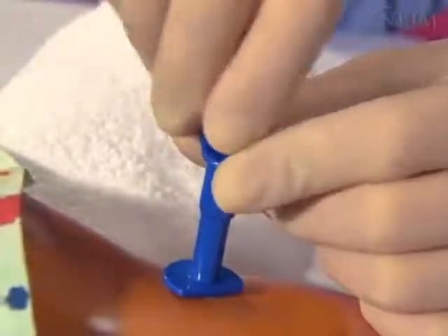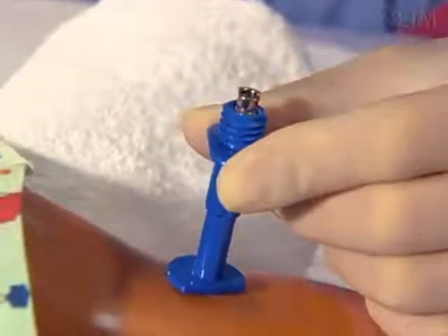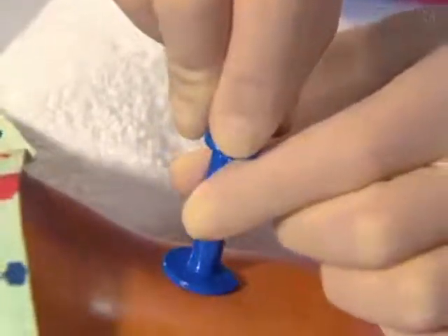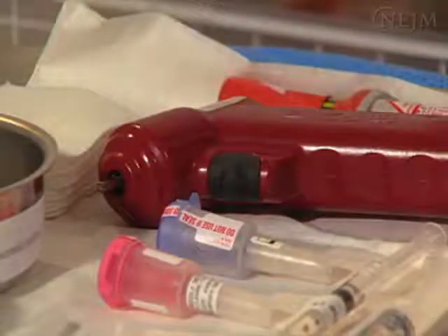Remove the needle cap and stylet. If the device has a supporting flange, adjust it so the surface is flush with the skin to stabilize the needle and to avoid inadvertent deeper insertion. Take care to avoid disrupting the needle while adjusting the flange. For power-assisted insertion, we will demonstrate use of the drill device.